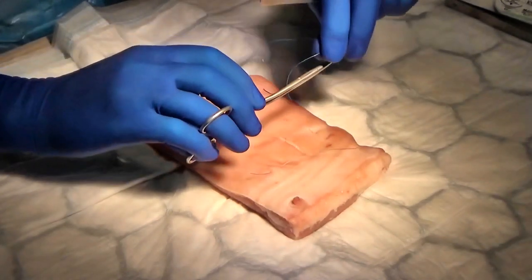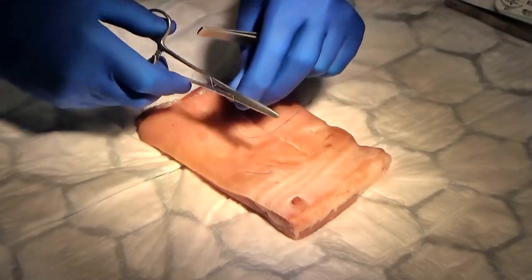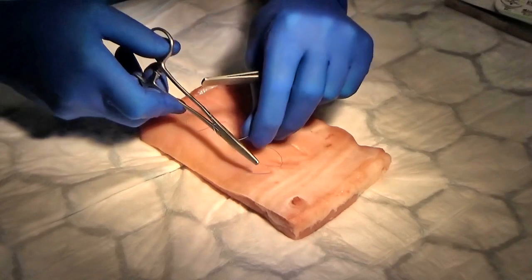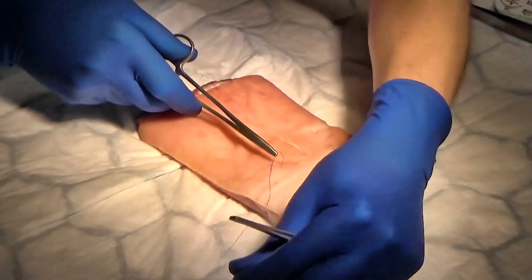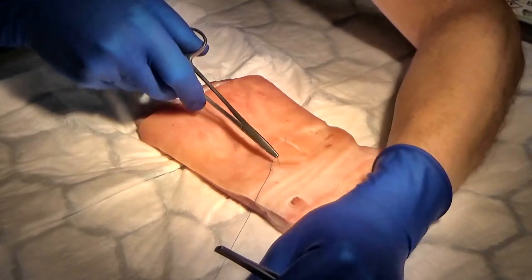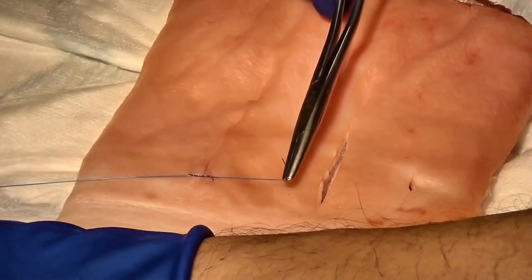You go once, twice clockwise, and you lay that knot down flat.